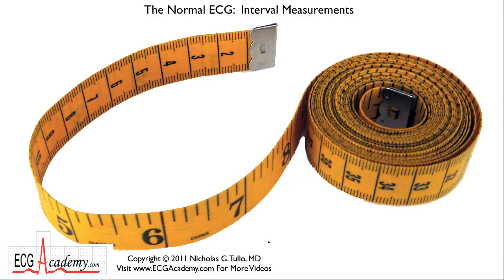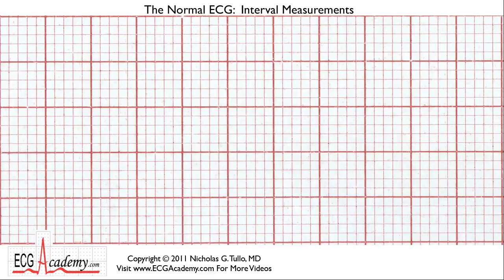So as far as measuring is concerned, we've got this tape measure that I kind of remember. My grandmother was a seamstress, and she'd whip one of these things out and start measuring all different parts of my body. But we're going to talk more about the ECG and how you measure different intervals, and you can start to make electrocardiographic diagnoses.